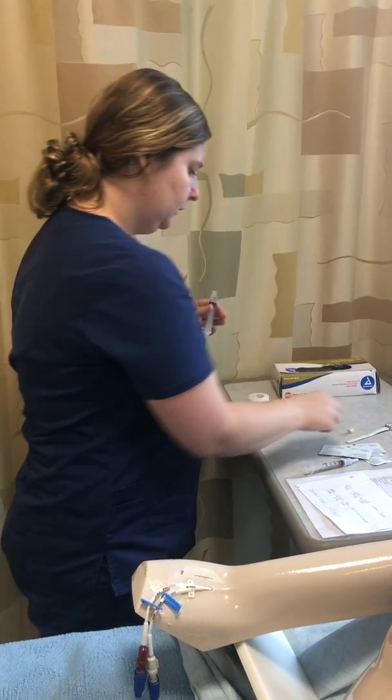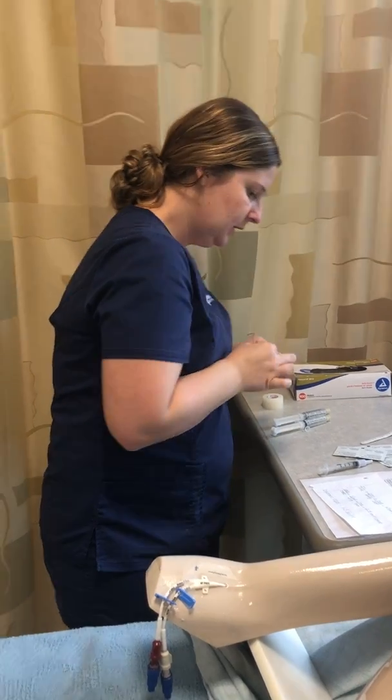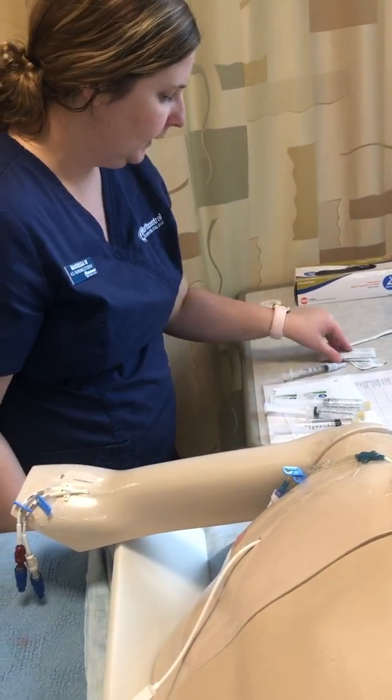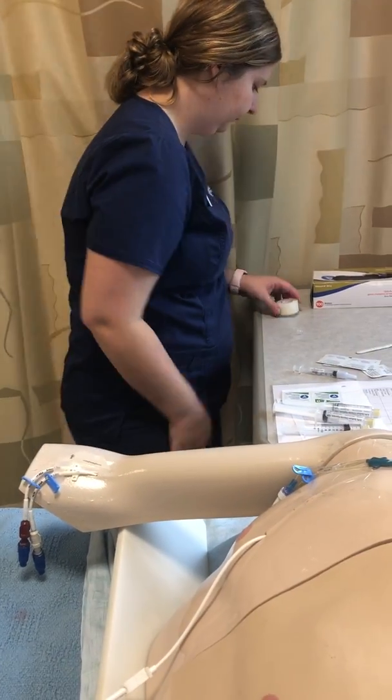Make sure there's no air bubbles. I'm going to recap for now. Then I'm going to bring everything closer. And then I'm going to put some gloves on here right away.